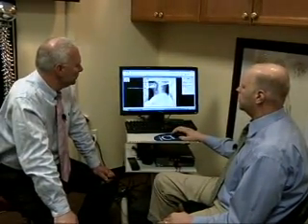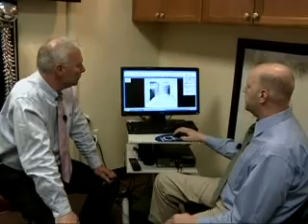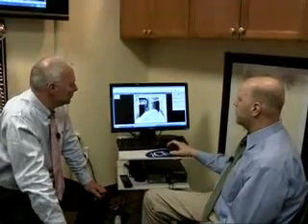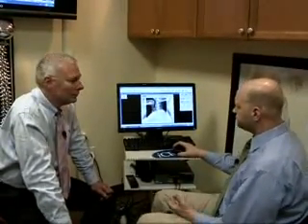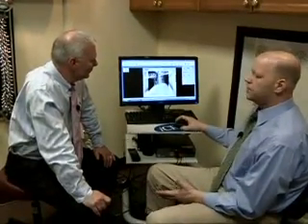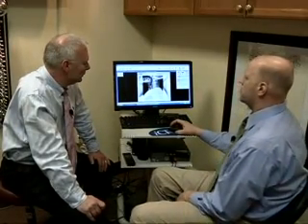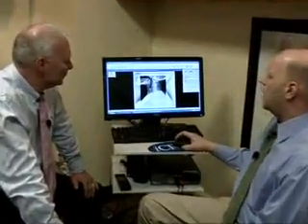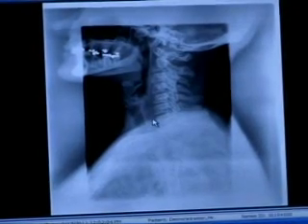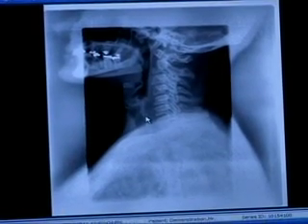So now we'll manipulate the image by taking that away, and we go by cropping down the image. We can actually change the density of the image. Now we're looking at a cervical spine, or a neck, in a side picture. And what we're looking for here, in general, like with general x-rays, is arthritis, degenerative changes, soft tissue injury, soft tissue swelling. That's the beauty of this, because it allows us to really see an extensive amount of soft tissue, which we couldn't see before on the x-rays that we took in the old analog days.